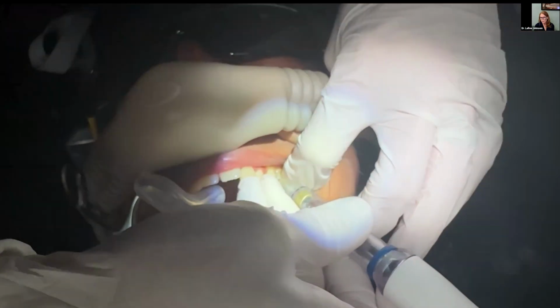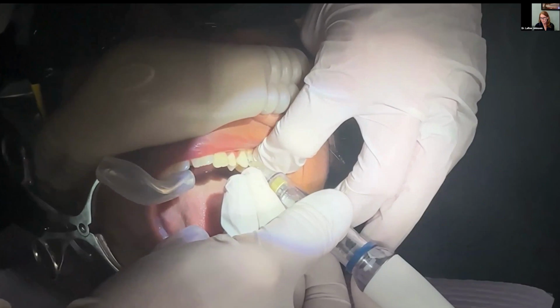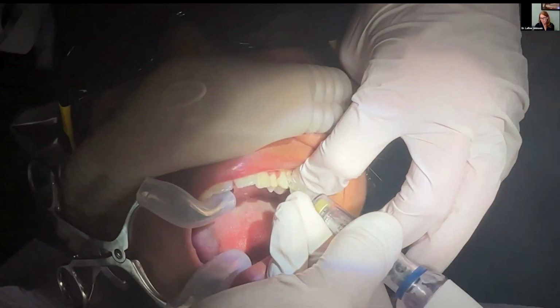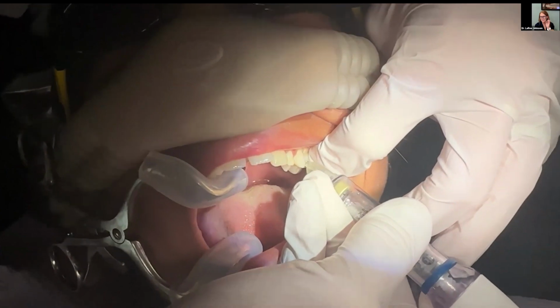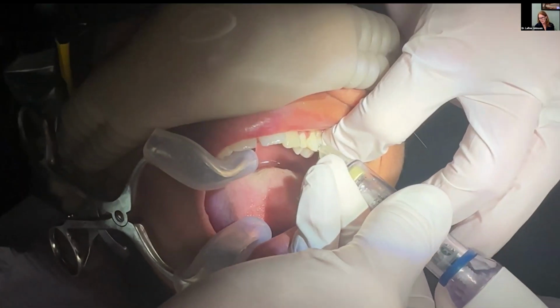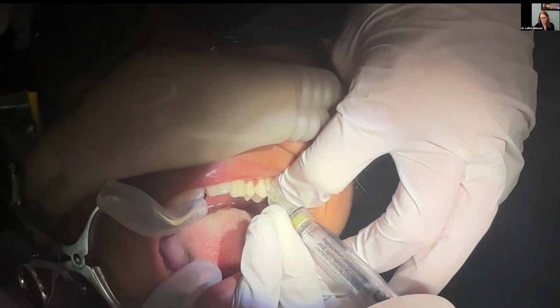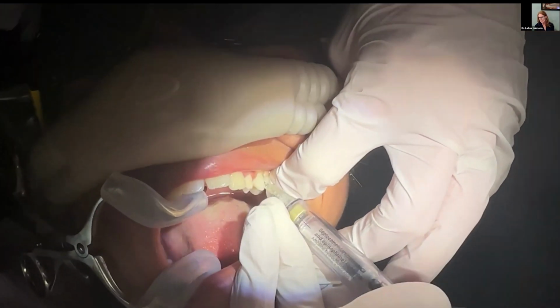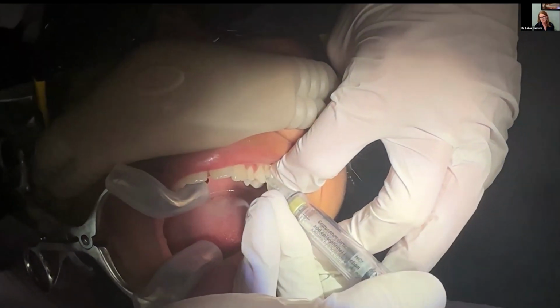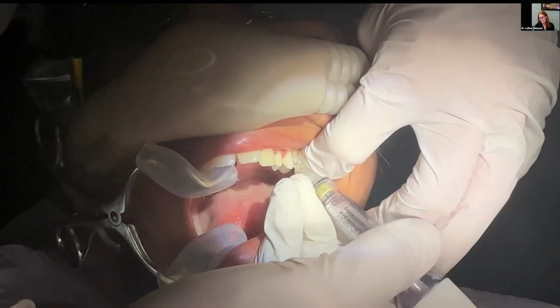But one thing to point out, and this is just regular time, so we're taking our time going through this. You can see the plunger going. When everyone gets their devices, they try to watch the plunger instead of the light flashing to know that it's actually going. You can make your eyes go cross-eyed watching that. And remember, when you're doing the drop by drop step, you're not going to see that plunger move. So don't even look at the plunger. The drop by drop step on the middle pedal, do your blanching, and watch the light blink. That's all you need to do.